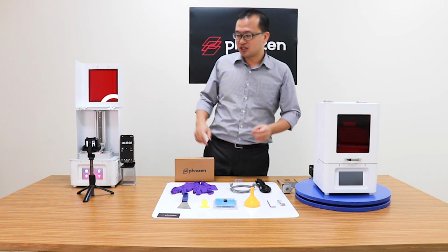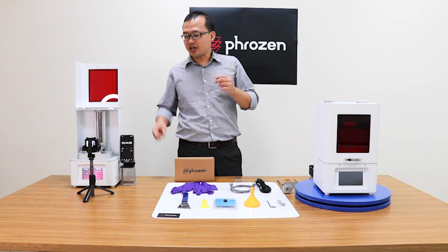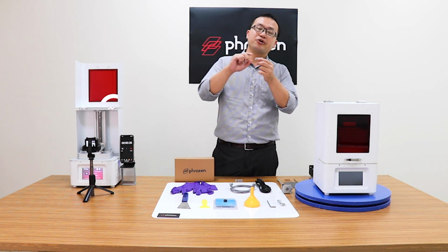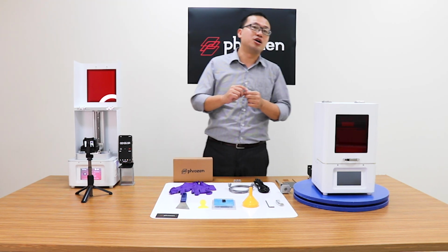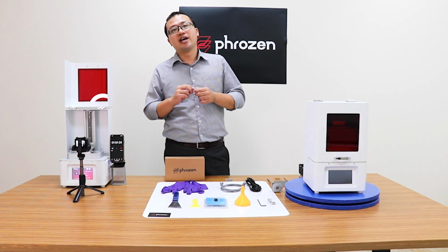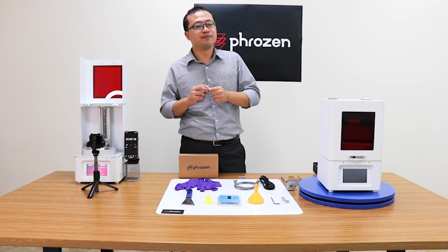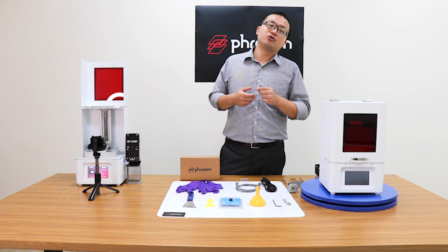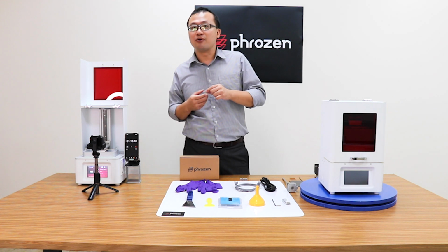Today we are using our NDA slide resin to do the live demonstration. This printer is now printing a dental model, the temporary crown. The model is about 2 centimeters high, and we are using 100 micrometers layer height as the slice layer height. The cure time we set is 1.5 seconds per layer. From our previous test, it will take about 15 to 20 minutes to finish. Let's see how it will work.